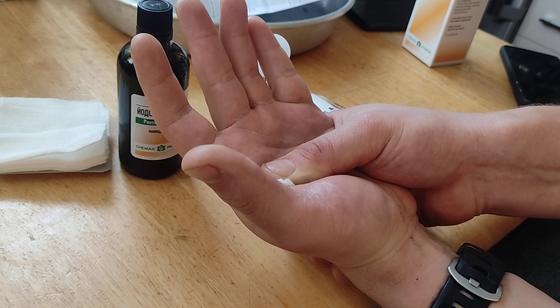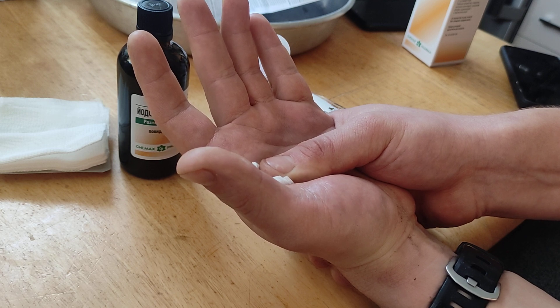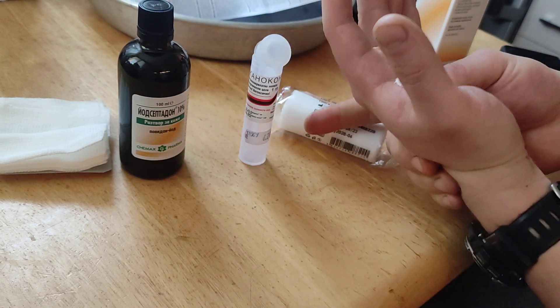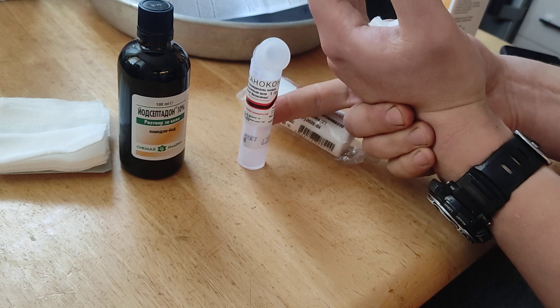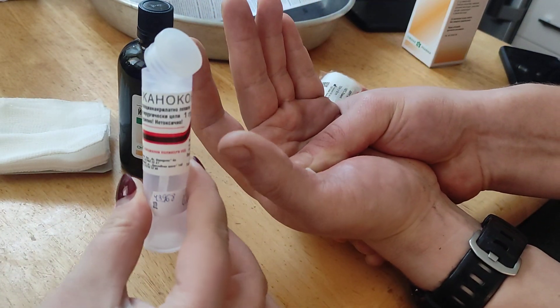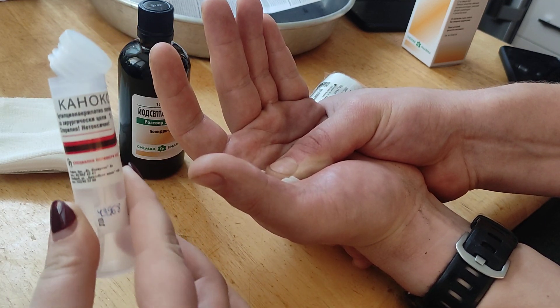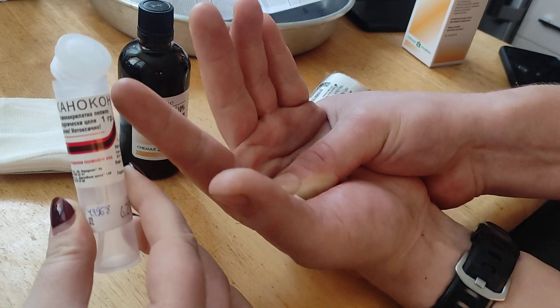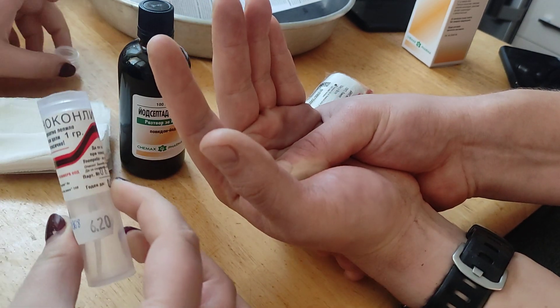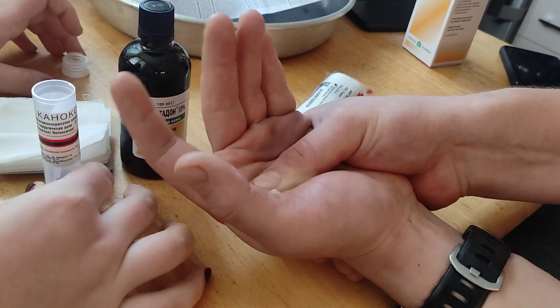First, if you can, go to the ER — go to the ER. But if you want to glue yourself, go for it. This is a medical glue; it's a super glue for people, and the difference is that it's more elastic and it reacts better with the skin. I bought it from the pharmacy. There was only one pharmacy in the city that sells this stuff. It's 3 euros.